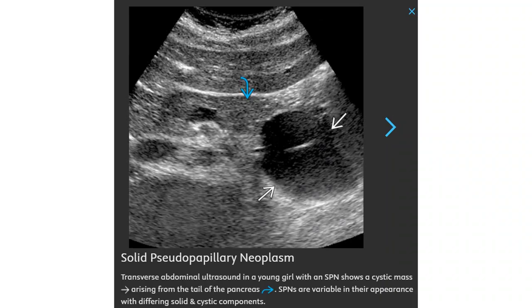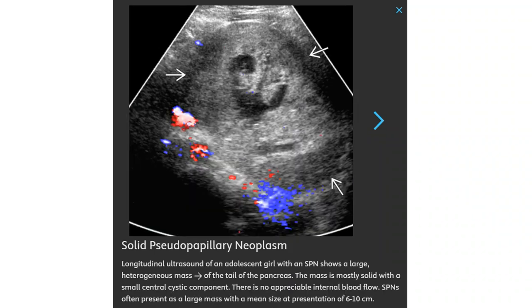This is the ultrasound of the abdomen in a patient with SPN, showing a cystic mass arising from the tail of the pancreas. They are variable in their appearance with differing solid and cystic components. The ultrasound of an adolescent girl with solid pseudopapillary neoplasm shows a large heterogeneous mass of the tail of the pancreas; the mass is mostly solid with a small central cystic component.